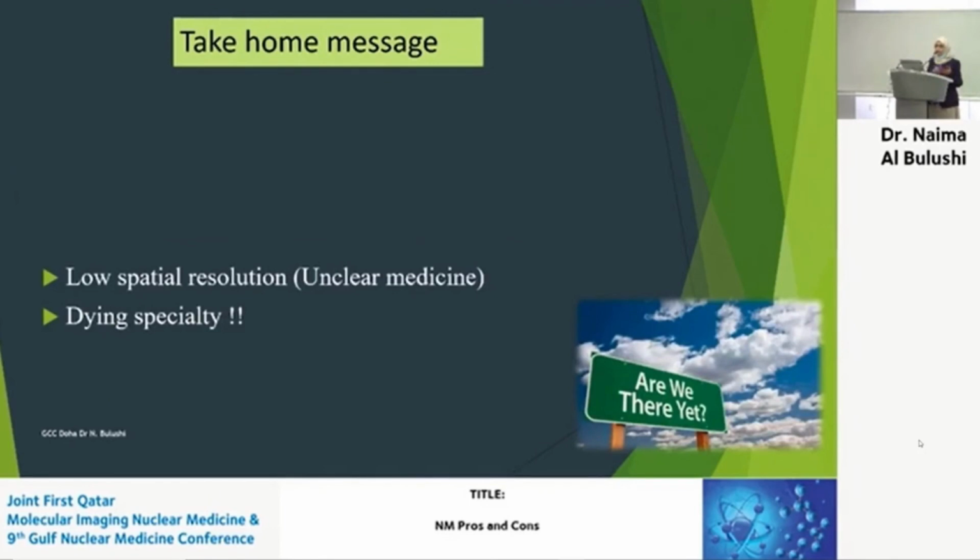What it is not is, and please refrain from using it, unclear medicine. People say it has low spatial resolution, and you can tell them yes, but that was in the 70s, prior to the invention of the computers. Now we have computers, we have the filtered back projection, we have the time of flight, we have a lot of things that happened in nuclear medicine. You just need to read about what is happening, the advances in nuclear medicine. It is no more unclear medicine. So please forget about it, don't even use it.